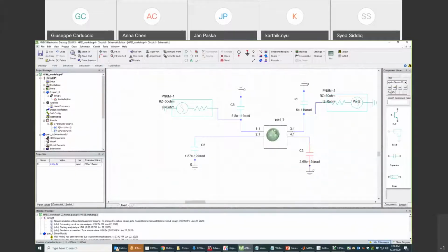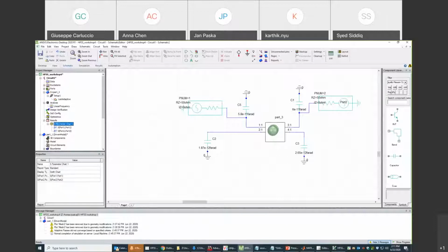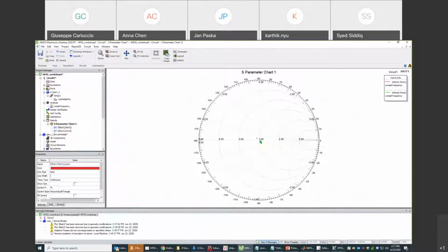So I set up already a circuit diagram. I imported the model that we had, which has the S matrix inside, and I want to drive it at port 1 and port 3. So these are my driving ports, and I have a parallel capacitor, and on the tuning port I have a capacitor in series on both coils. I computed the capacitors before already, to give me a match in the excitation port. So then we can analyze it, and then we can plot the results, and we can see that both coils are matched.